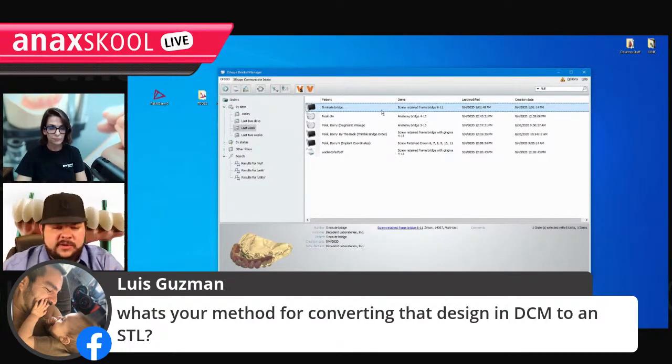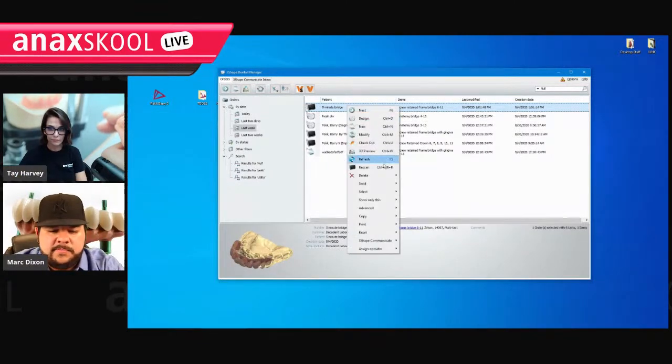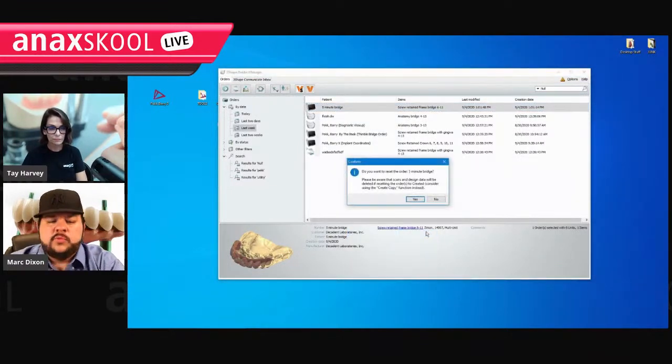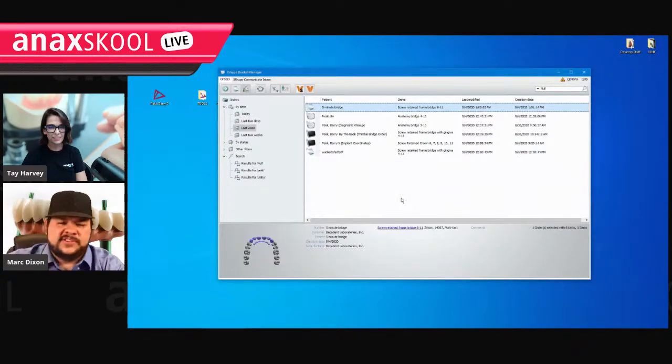So that's all we did. Is this not lined up? Yeah, that's great. So, 5 minute bridge. I'm going to hit... I finally did something wrong. Reset created, that sets it back to created state. Now it's just created. It's back before you scanned it and everything.